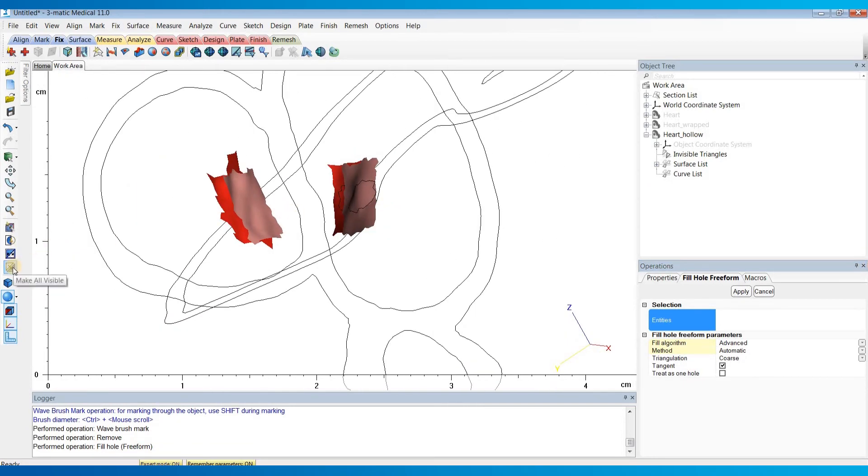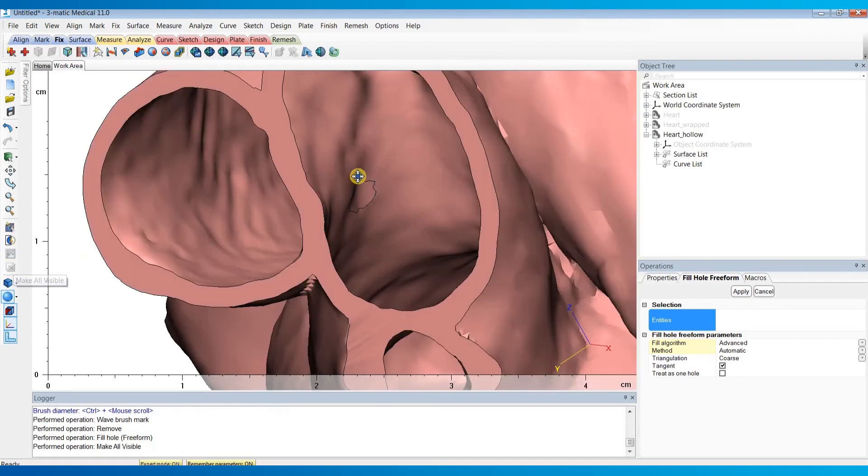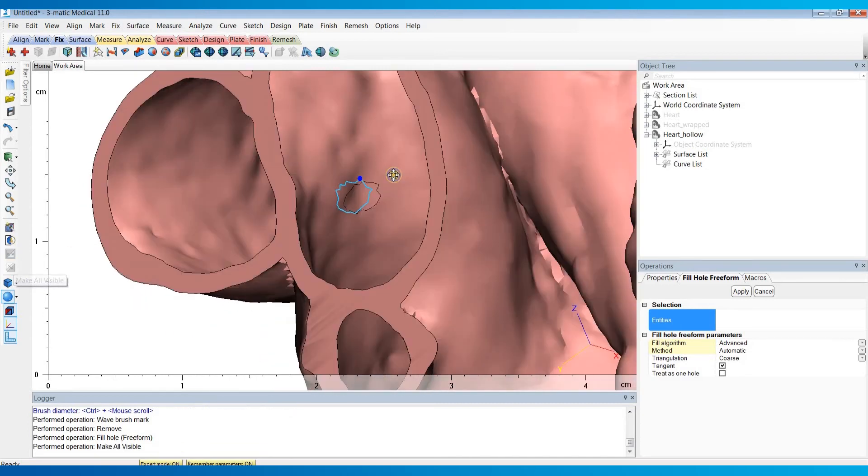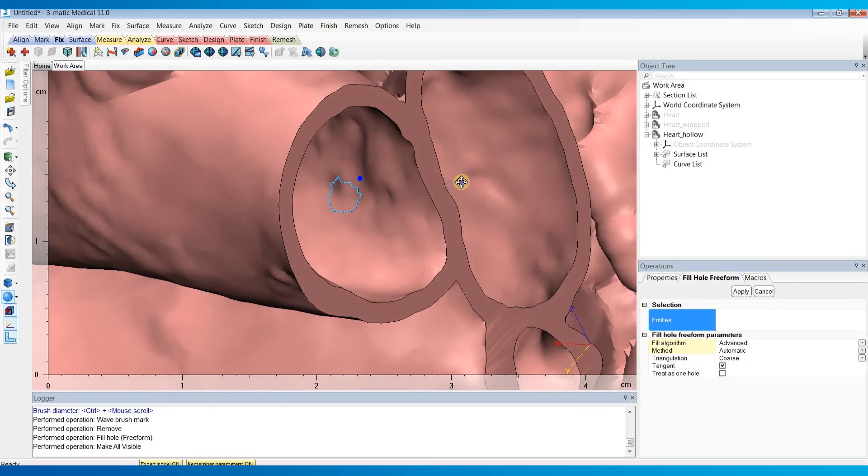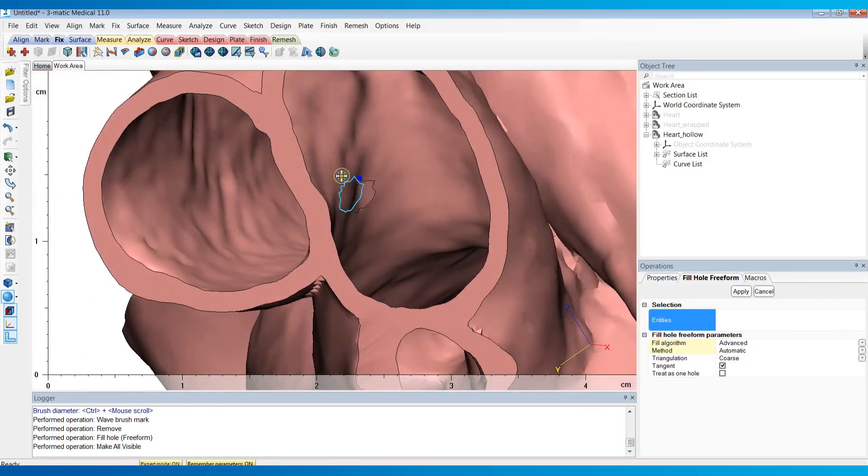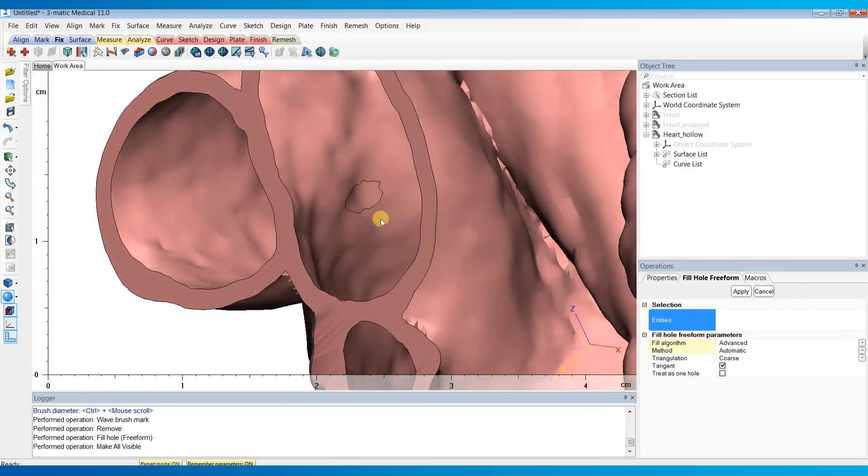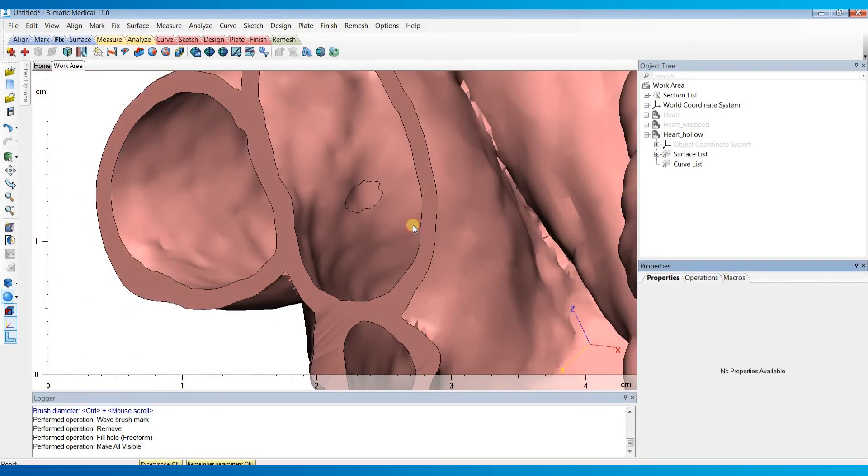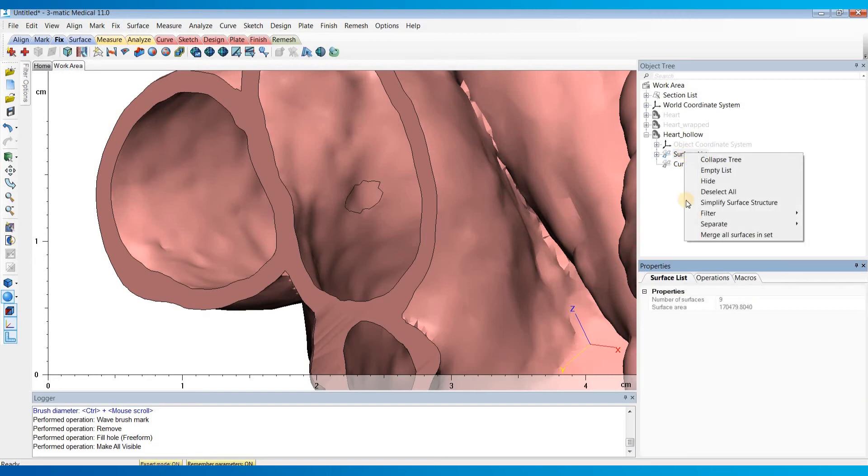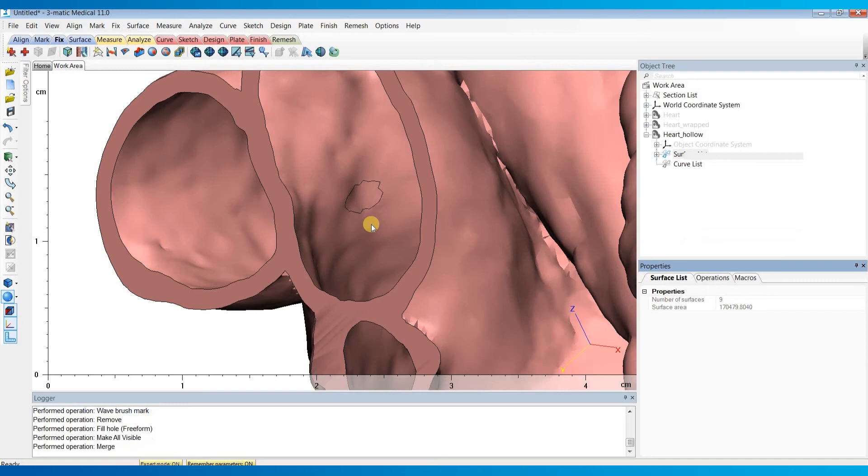Now if we hit this make all visible button, the rest of our model will appear and we'll now have a wall between there and no holes will exist. If you want to combine these surfaces so you don't see those black lines, you can just right click on surface list and merge all those surfaces into the set.